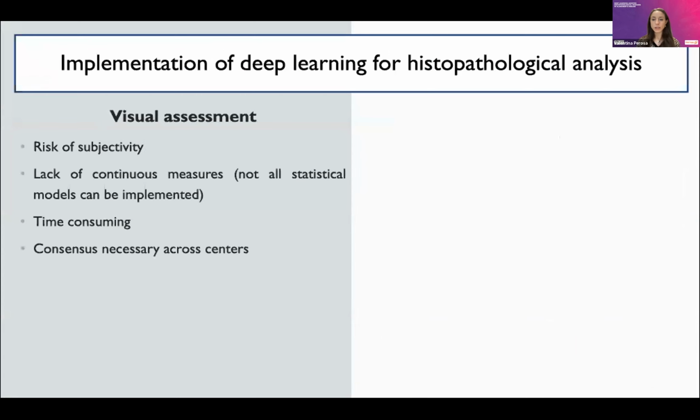And one of the things that we did more recently in the lab, as I was mentioning, was also to take this work a step further and to start using artificial intelligence, and in particular, Aiforia, in order to quantify histopathological markers of AD and CAA. And as you probably know, most of the time studies use semi-quantitative scales in pathology in order to determine a particular marker. For instance, we can talk about absent, mild, moderate, and severe CAA. Sometimes, alternatively, manual count is used to determine the number of cells. So these are all things that Lucas just mentioned before.